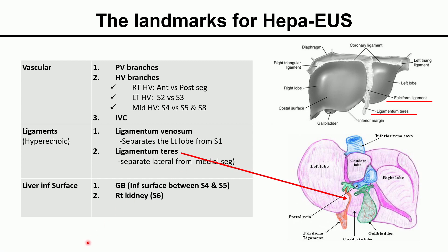The liver inferior surface landmarks are the gallbladder and right kidney. The gallbladder is close to the S4 and S5 segments. The right kidney is in contact with S6.